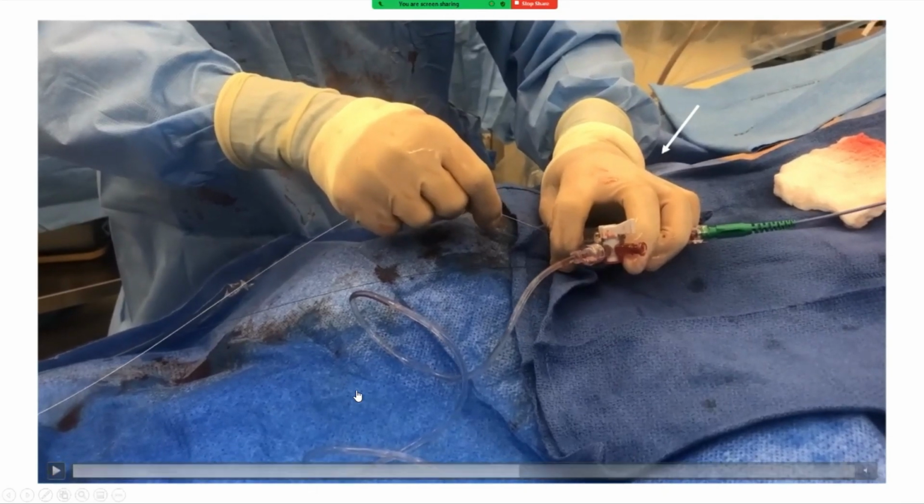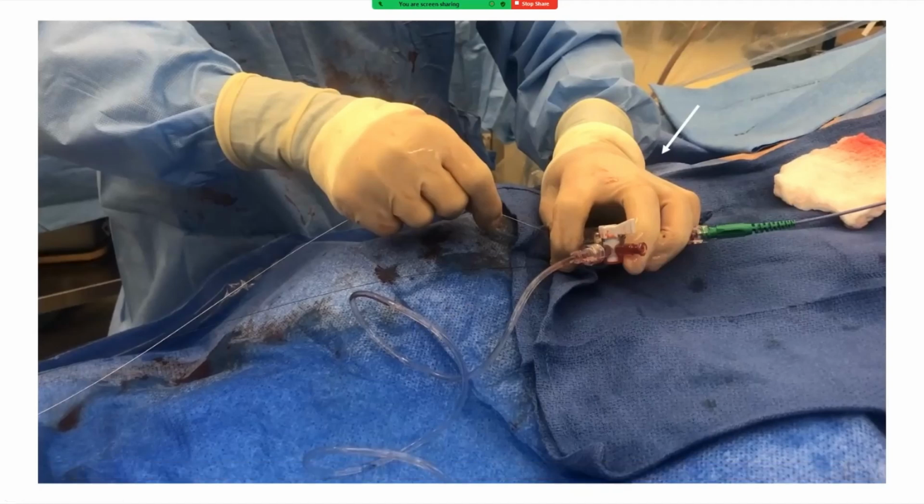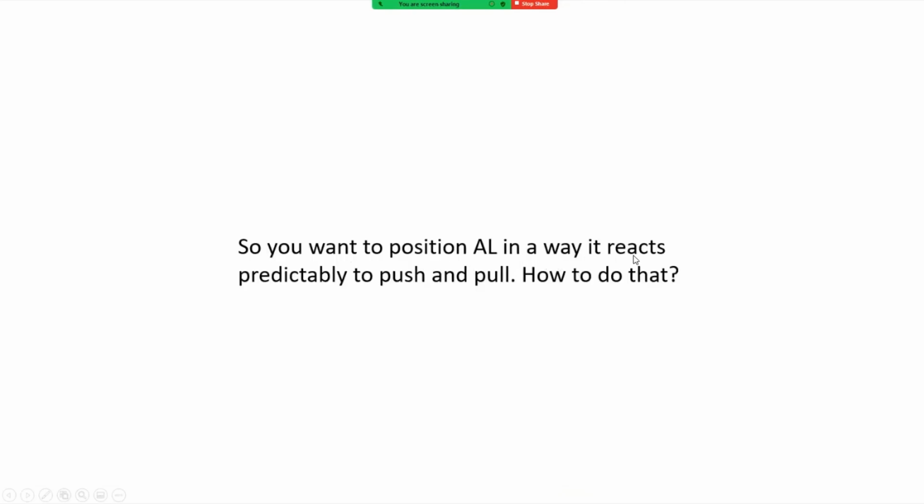That technique can be problematic with an Amplatz left guide, because the Amplatz left does not always react in a predictable manner. When you pull on the Amplatz left guide, it may paradoxically dive in, especially when it's duck-shaped and coaxial. That can happen throughout the case as you're pulling the balloon, pulling the stent, maneuvering your wire. So that's why throughout your case, you want to position the Amplatz left in a way that it reacts predictably to push and pull. And how do we do that?